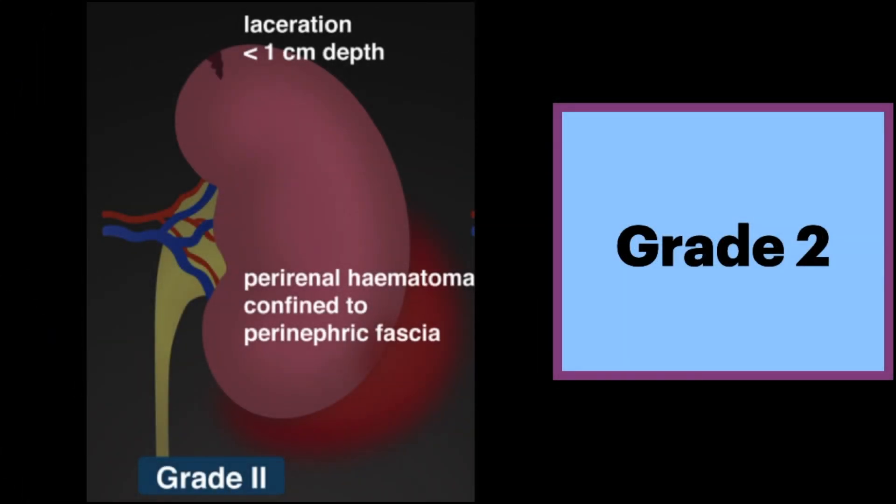Next is a grade 2 injury. There is a laceration with a superficial cortical defect less than 1 cm, typically linear and hypoattenuating. There is no associated collecting system injury. If there is a hematoma, it's confined to the perinephric fascia. Blood dissecting along the perinephric septa results in stranding or cobwebbing.